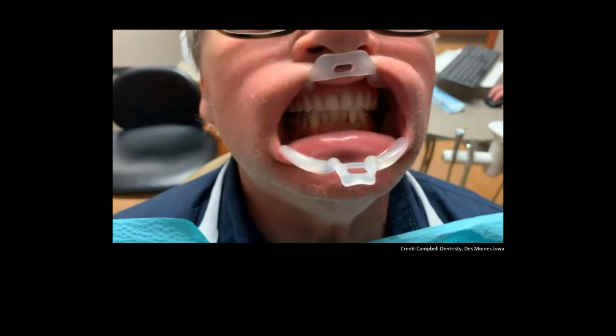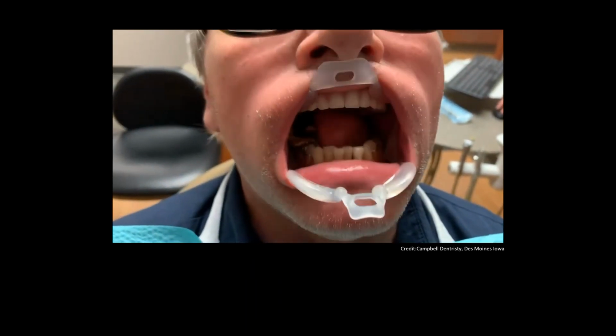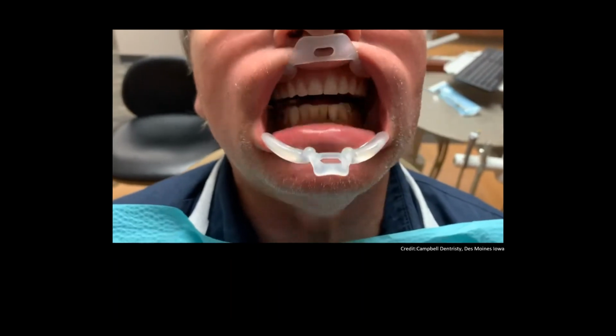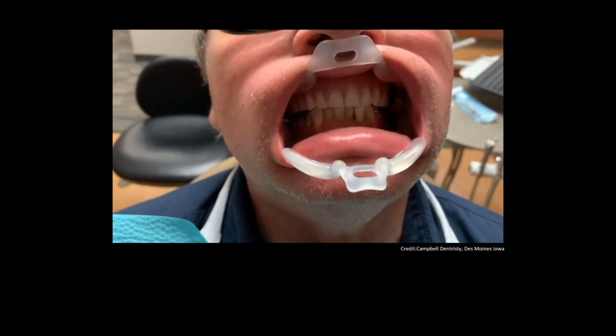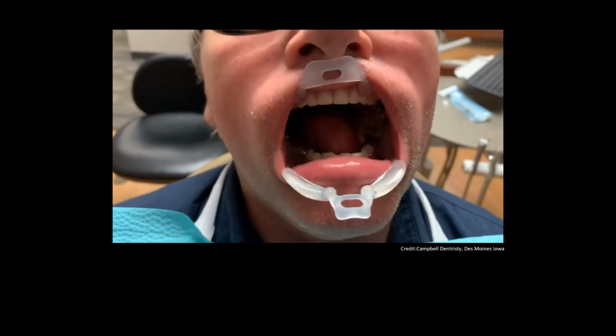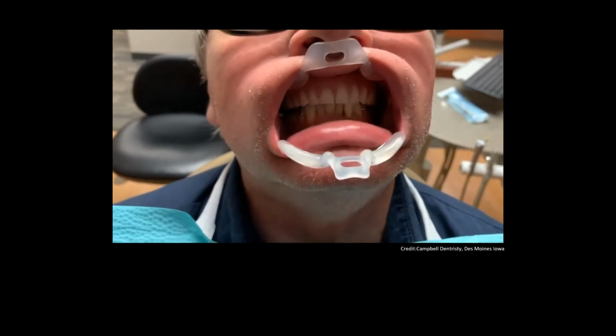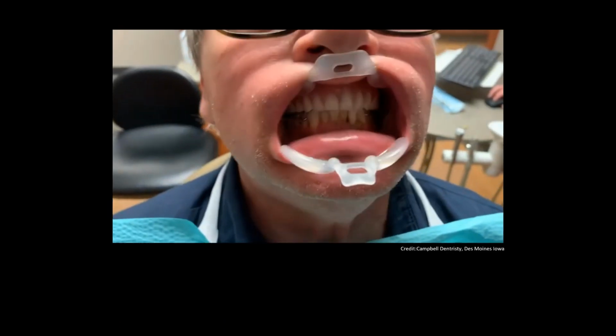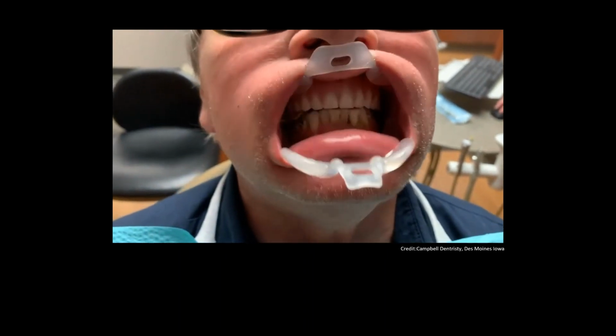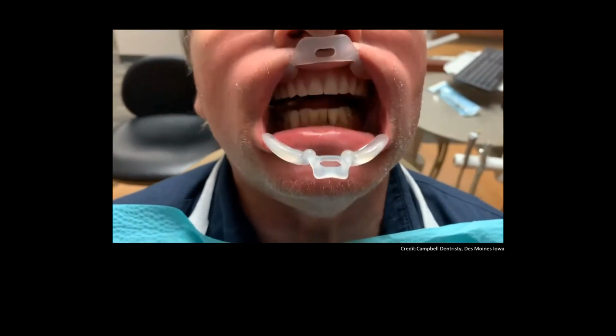Look at him chew. Is he chewing up and down? No. He's chewing at an angle. Look at that. That's programmed in us. That's subconscious. That chew cycle exists. That thing runs. It's always there. Okay? Yet, how did we set the teeth on an articulator? Not to mimic that, that's for sure.